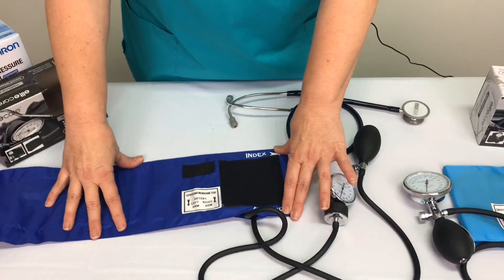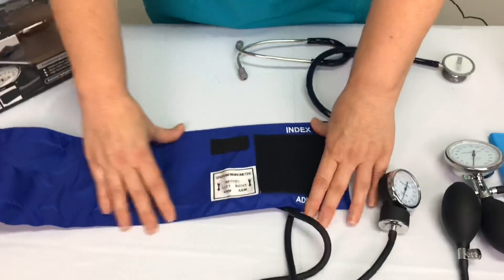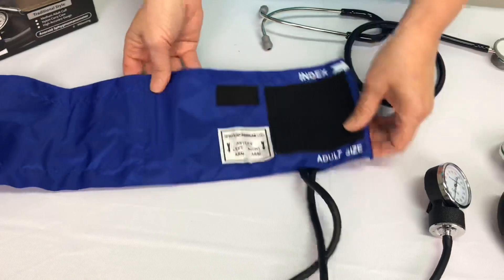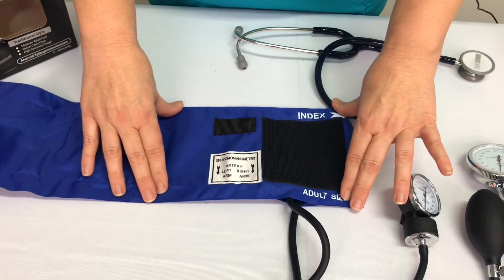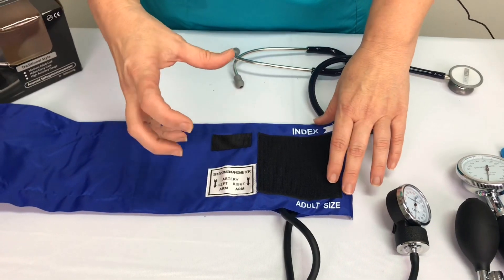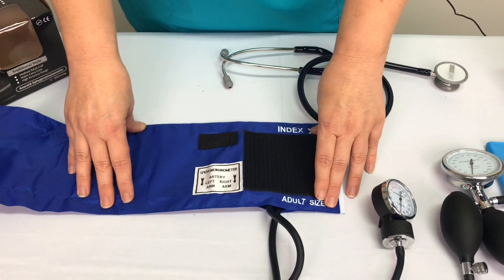Here we have our standard cuff — it has two tubes, one to the bulb and one to the gauge. Inside the cuff is a bladder about this big. This is what goes around the arm, and as it inflates and is wrapped around with the velcro, it compresses on the artery causing occlusion. Then as we release the pressure it allows blood flow to return, so we can start to hear the sounds that measure the systolic and diastolic pressures.